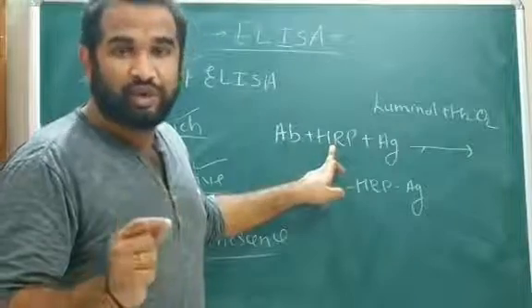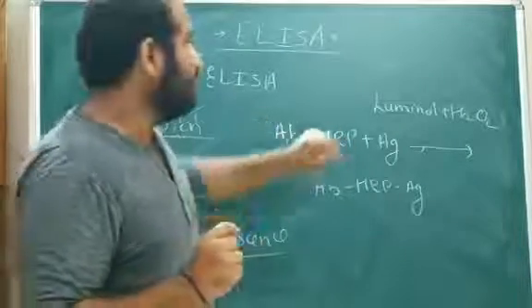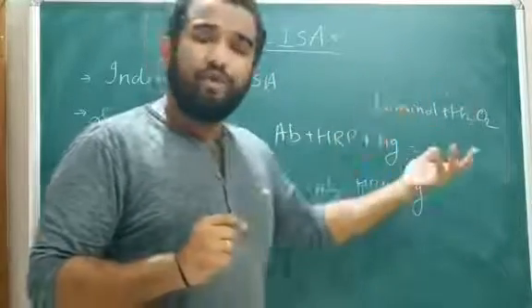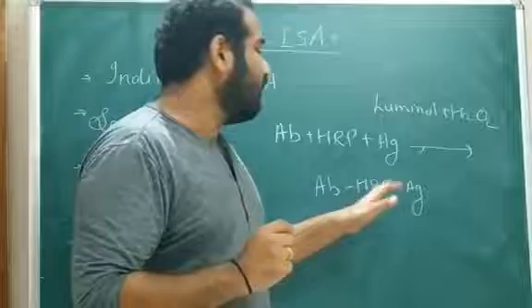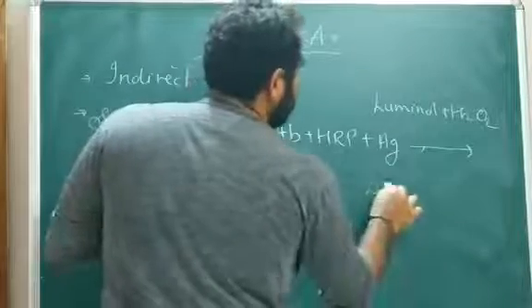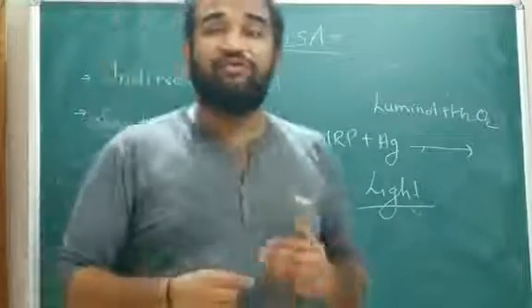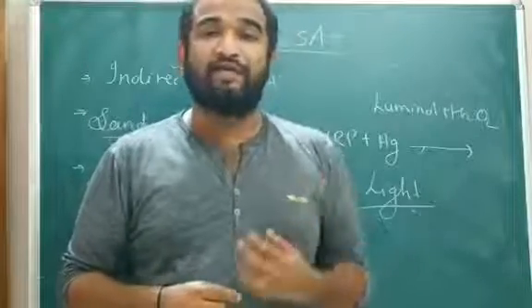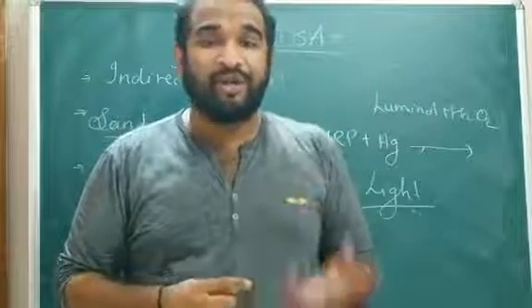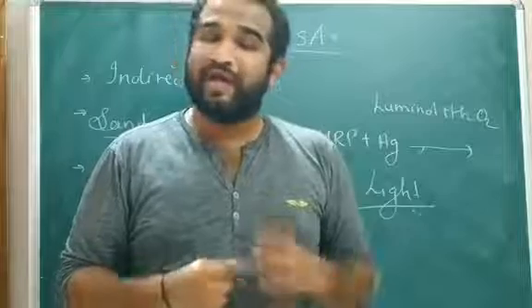To this the substrate H2O2 is added, and the luminol is going to oxidize and emit light. It is 100-fold more sensitive than the color change test, that is the ELISA test, and if some enhancement agents are added, it becomes 200-fold more sensitive than the ELISA test.